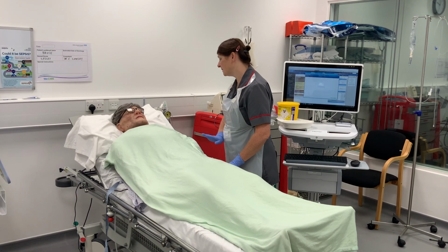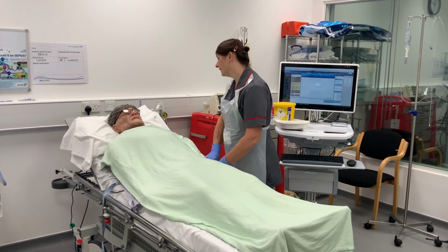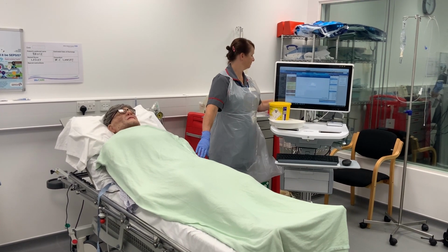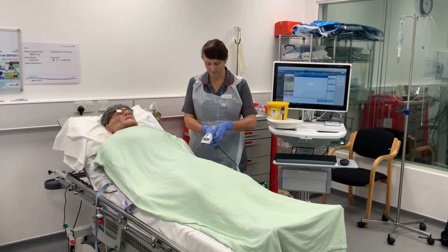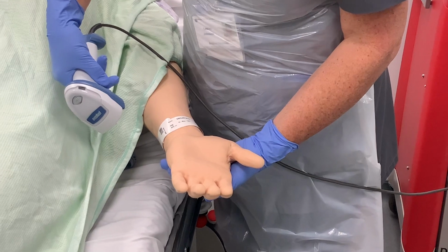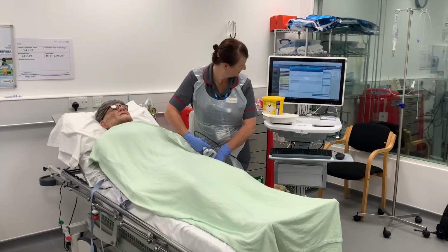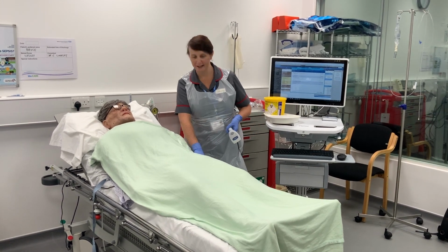Thank you, that's fine. I'm just going to scan your wristband now so that I can check what bloods are due to be taken today. There we are, they've come up on the screen now.